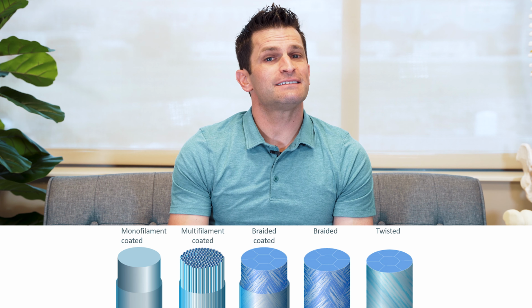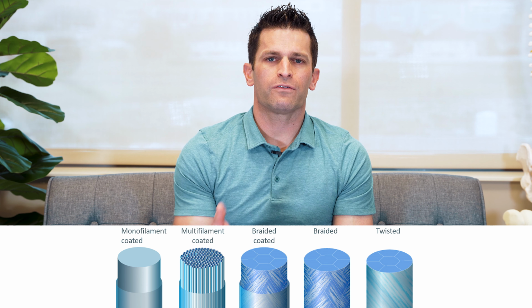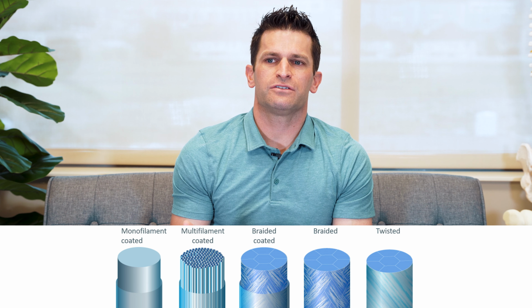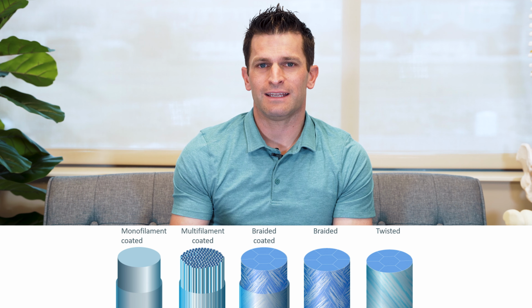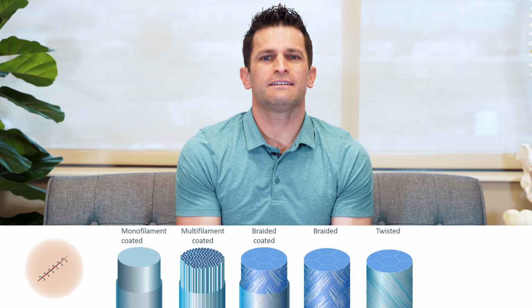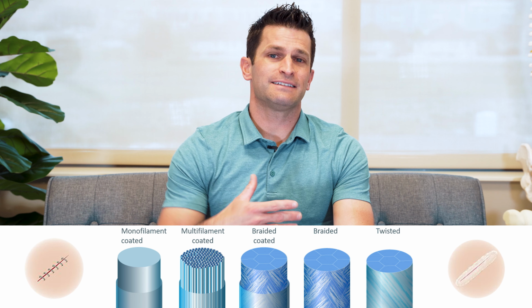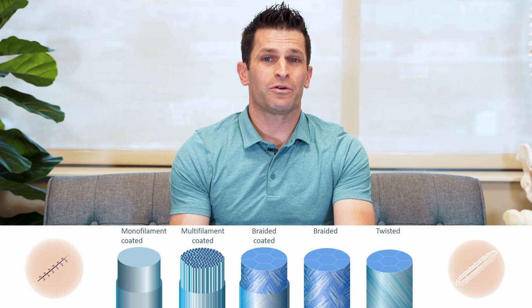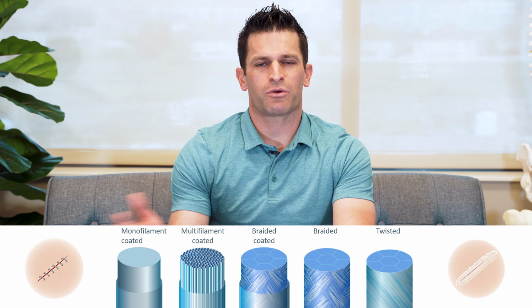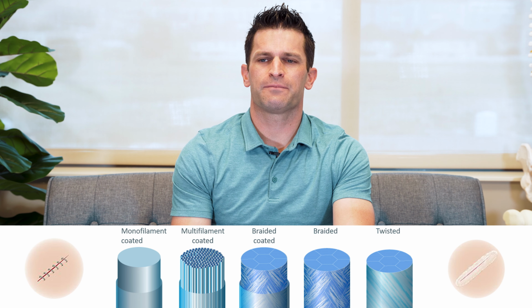On the skin itself, we have the option of a monofilament suture that absorbs, a monofilament suture that does not absorb and needs to be removed, staples, or skin glue. I like skin glue because it doesn't have to be removed. You don't need a dressing, and you can shower with it because it blocks water from coming in. Probably shouldn't soak underwater though for a few weeks.